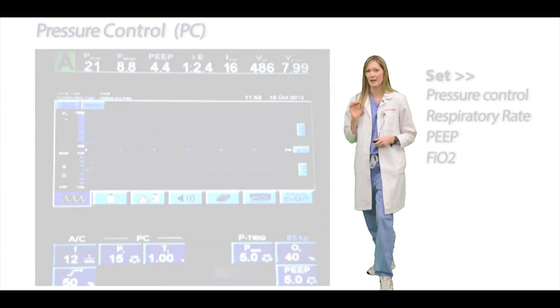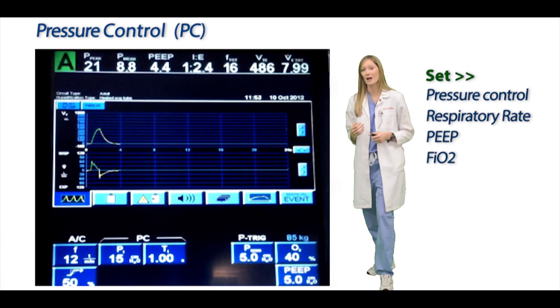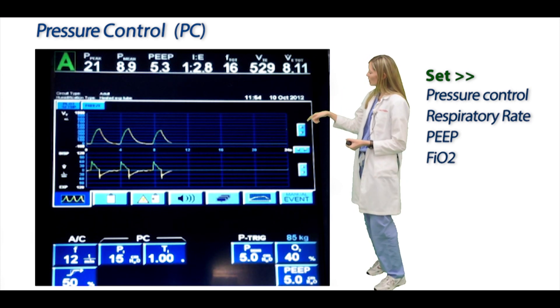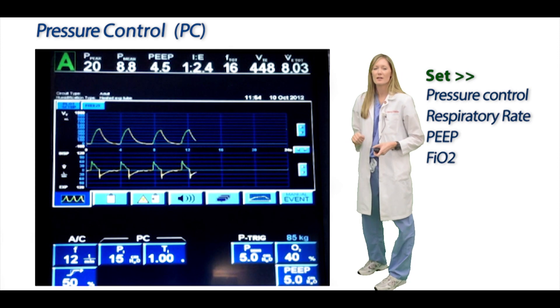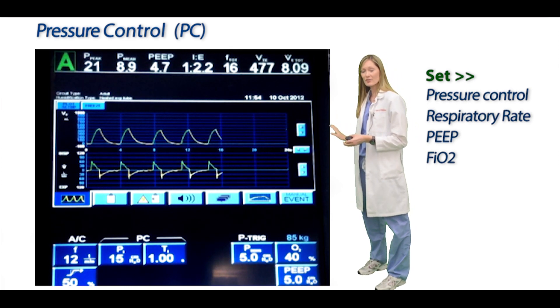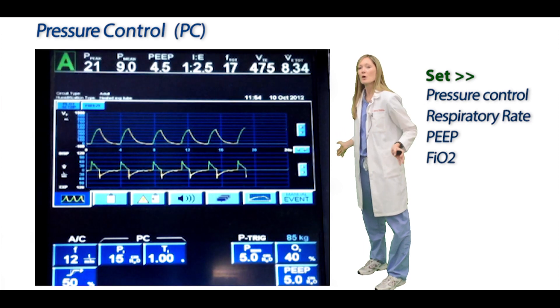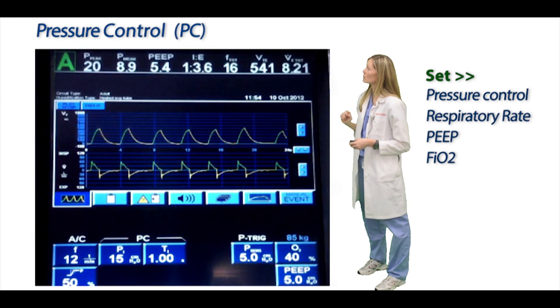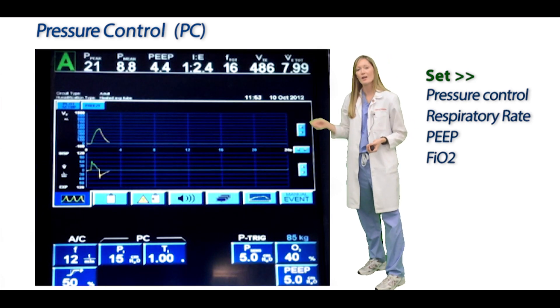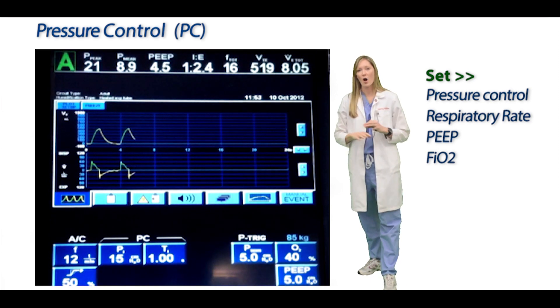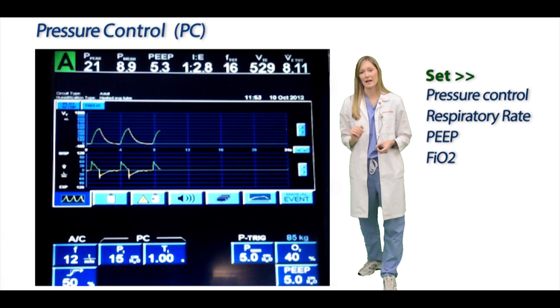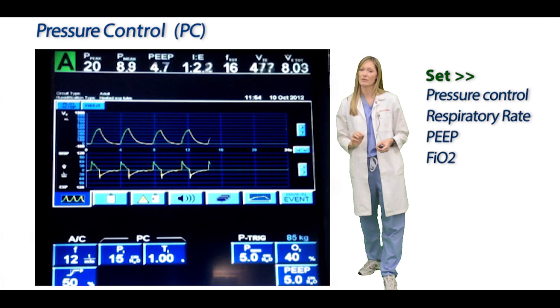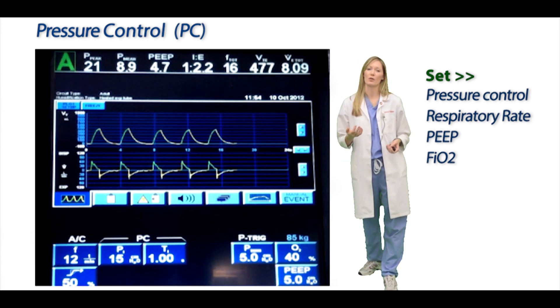Let's move on to pressure control. We don't use a lot of pressure control, but it works with the same concepts. Just as we could control volume previously, here we're controlling pressure. You set your peak inspiratory pressure — here set at 15 — while PEEP stays at five, just as with other modes. Your combined pressure combines both together, so peak inspiratory pressures will be around 20 in this mode, and tidal volumes will vary breath to breath. All three of these modes — ACVC, ACVC+, and pressure control — are fully supported breaths: if the patient takes more breaths than the set rate, all of those breaths are fully supported.